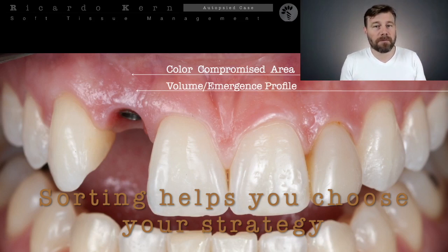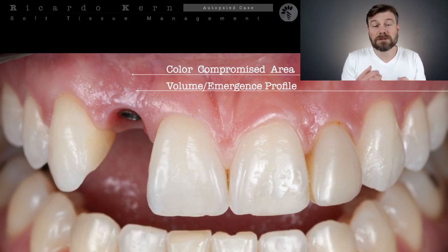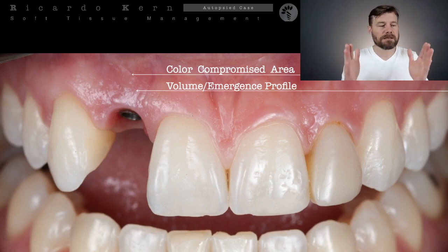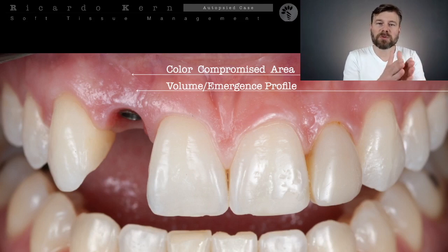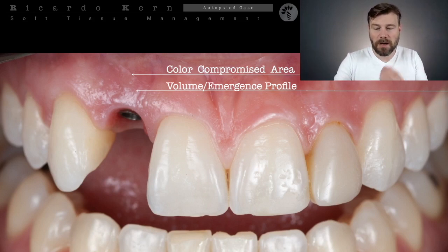Another common problem is the lack of volume, or the loss of volume. As you know, when you have the implant in place, according to the way we preserved the socket, with immediate implant placement or a healed site, as time passed, we lost some of the volume. And what happens is that we don't have the proper emergence profile for this crown. So we need to increase the volume to have my crown with exactly the same emergence profile as a natural crown.